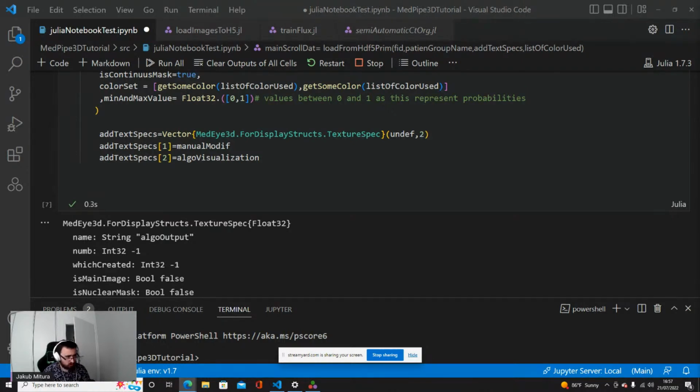Maybe this is the first question. Because layout syntax error is probably not Julia related and not related to this one. But in order to be sure, you can also try a different patient.